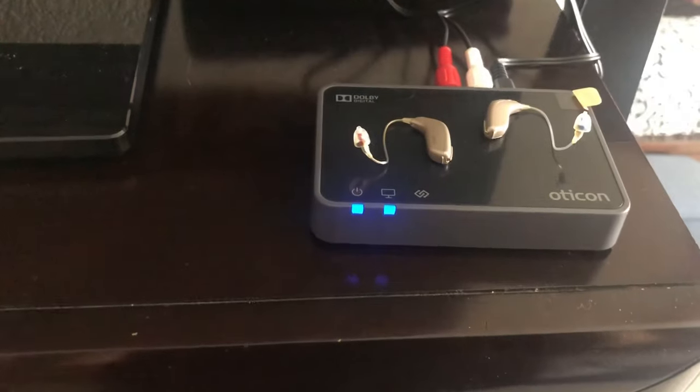One quick tip regarding rechargeable hearing aids: you'll need to turn them off and back on. The easiest way is to set them on the charger for a minute, then take them off — and then you have those three minutes to place them on top of the box to get them paired with the TV box.